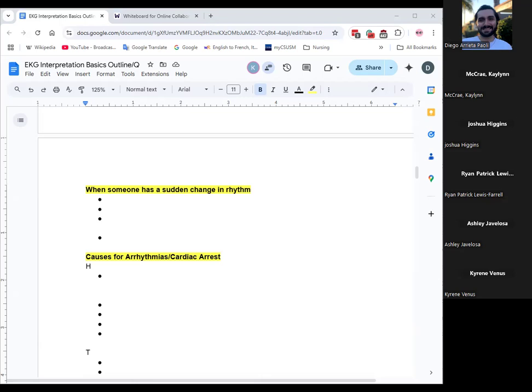If the connections themselves are bad, like we talked about before, if there's some kind of other electrical activity that the leads are picking up on. I think one of the examples in the lecture you guys had was if the bed or something catches electrical impulse from that, that can also affect it, and it's reading something that doesn't exist.